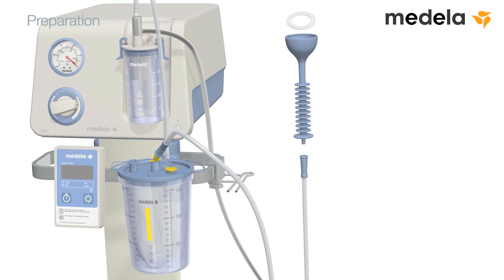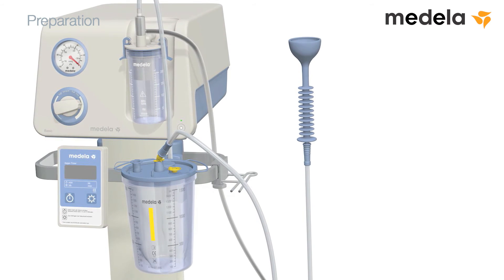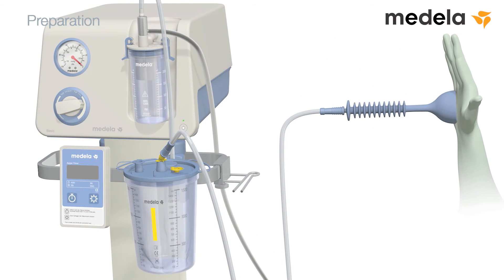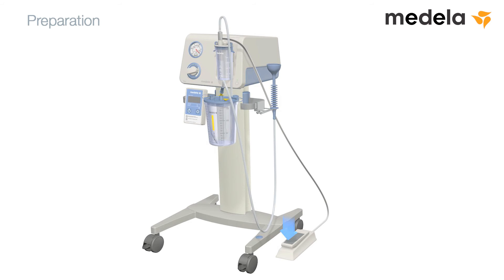Remove the protective disc from inside the cup and attach the tubing to the cup. Test the vacuum against your sterile gloved hand. Return the foot-controlled vacuum regulator to its resting zero-pressure state by pressing the back part down using the heel of your foot.